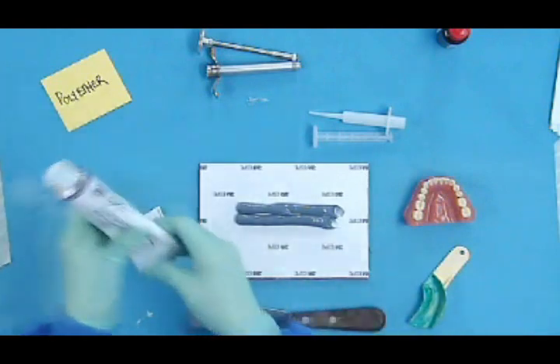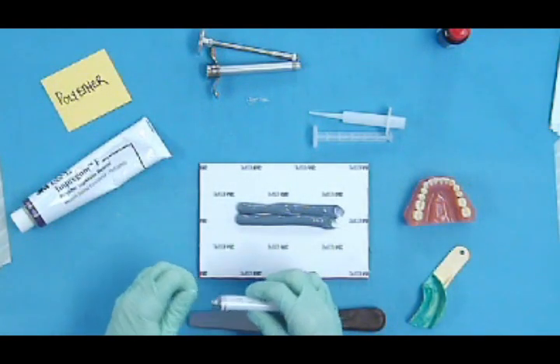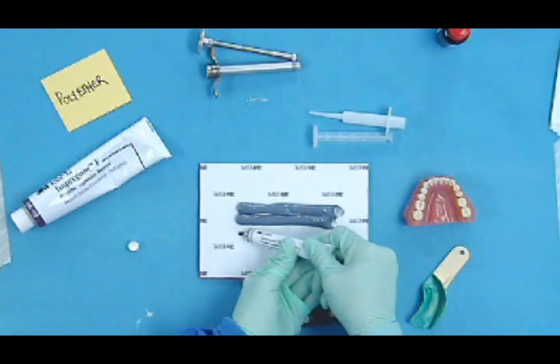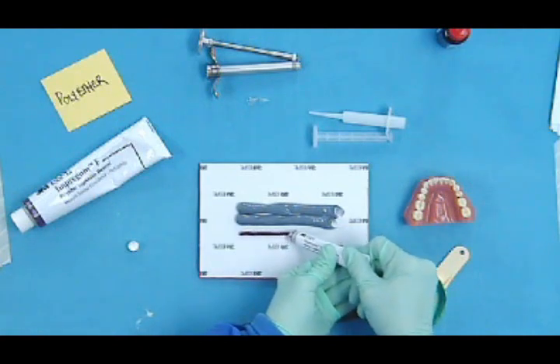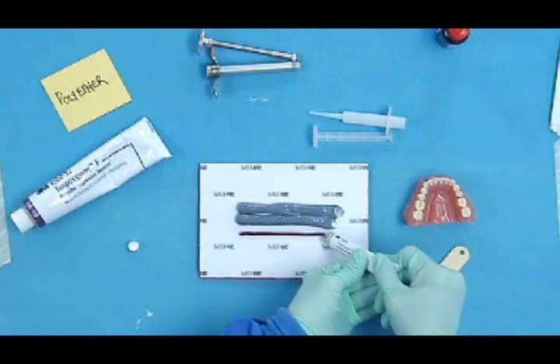This is one of the prettier impression materials because you can see that that's kind of gray looking, but our catalyst, which is in a tiny tube, is red. So when we mix them together, we're going to get a pretty purple material.